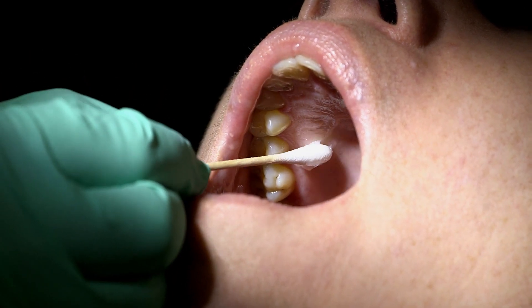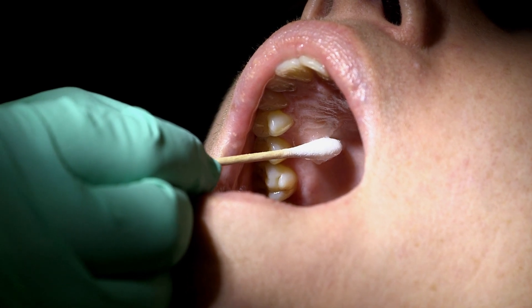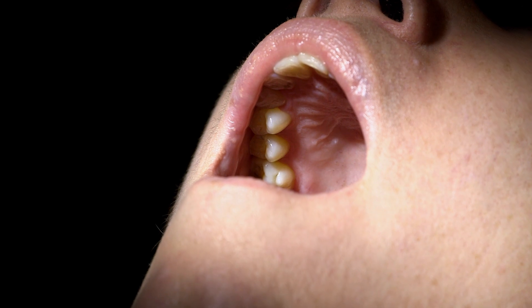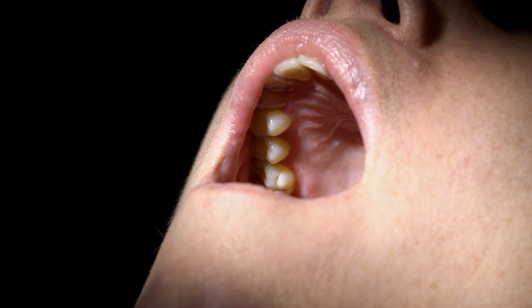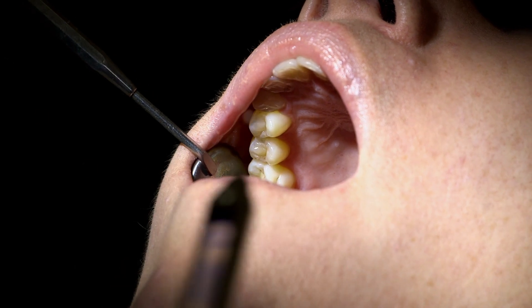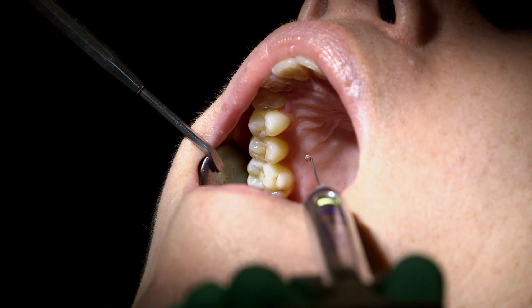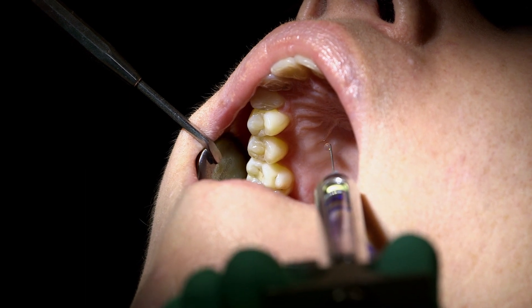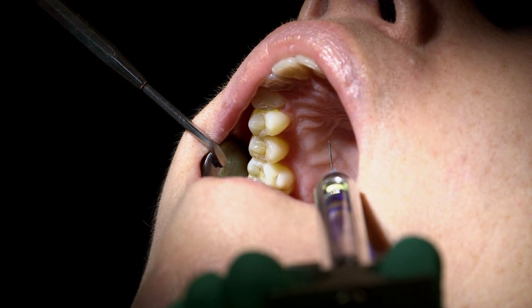A short needle is required for the palatal infiltration. The target bony site is at the greatest angle of the palate and the soft tissue landmark is at the maximum tissue thickness of the palate. The syringe is oriented so that the needle is inserted at approximately a 45 degree angle to the palate.